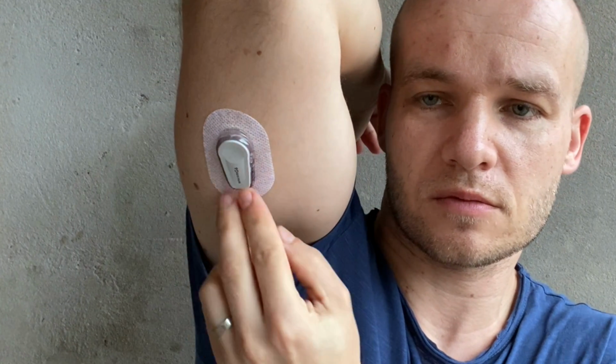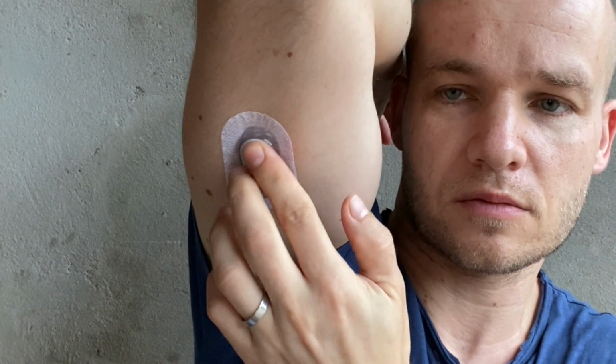Now we will not have to do that anymore, which on one hand is good, but on the other hand there are users who extend the life of the Dexcom G6 sensor by doing a little trick, so removing the transmitter from the sensor and then connecting it back to the same sensor. And this little trick enables them to use the same sensor for more than 10 days. And it seems that it will no longer be possible with the G7 and people will just have to purchase more sensors. So I expect there to be a bit of controversy around this topic.